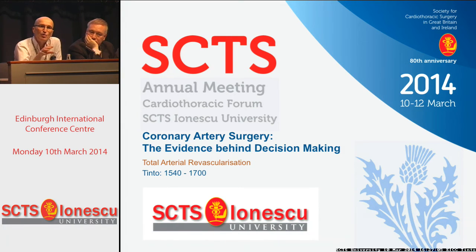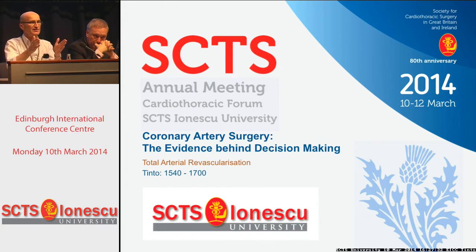In my own hospital, we have used extensively the SPY camera and TTFM. And we published this in JTCVS, that the problem with TTFM is, as Vipin said, in 90% of the grafts you assess, you get very convincing pictures of diastolic flow, low pulsatility index, and high flow in your grafts. So you know the graft is fine.